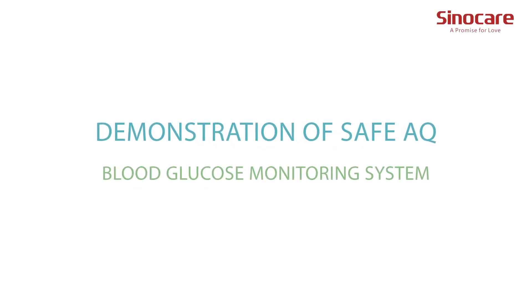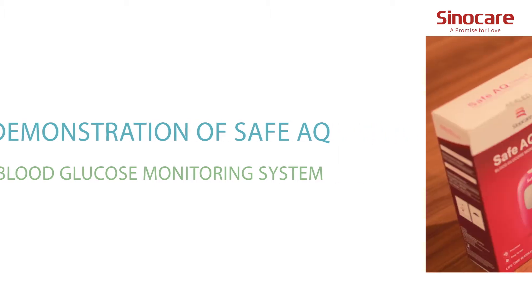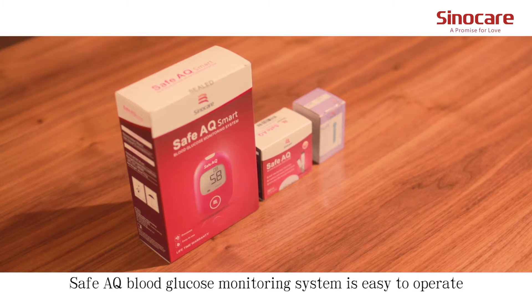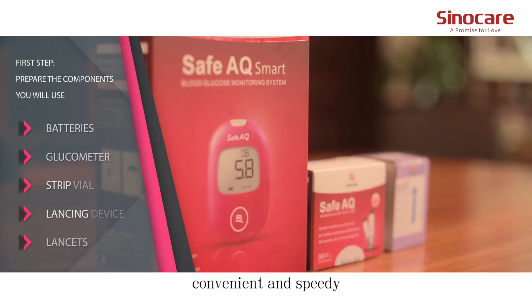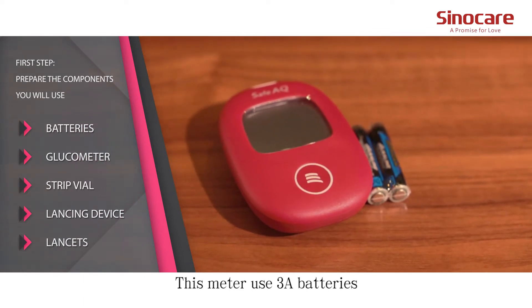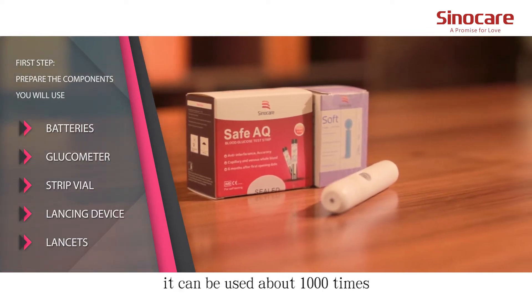Demonstration of the SafeAQ Blood Glucose Monitoring System. The SafeAQ Blood Glucose Monitoring System is easy to operate, convenient and speedy. This meter uses 3A batteries and can be used about 1,000 times.